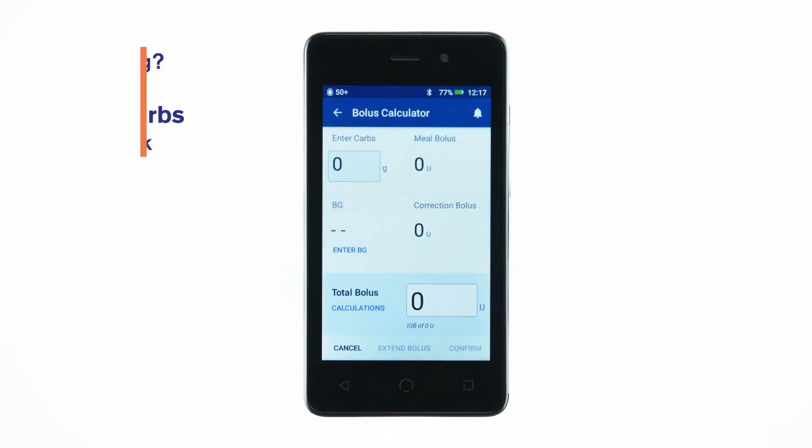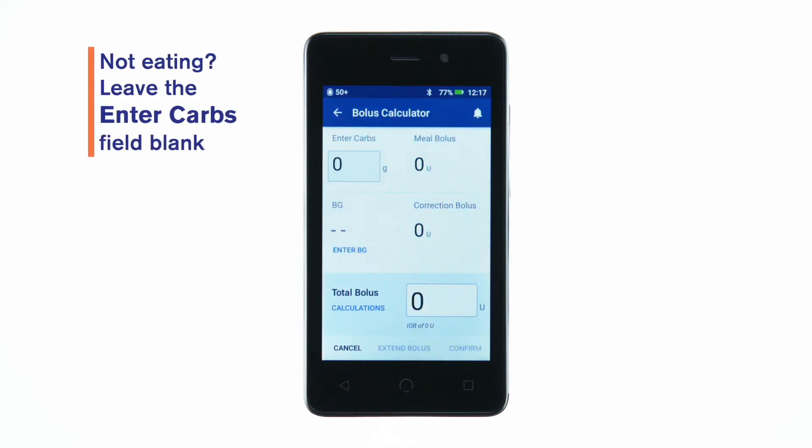If you already know the amount of insulin to deliver, tap the total bolus field and enter the amount, then tap the check mark.